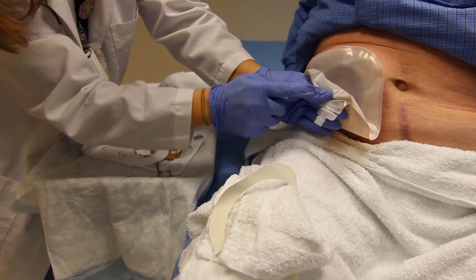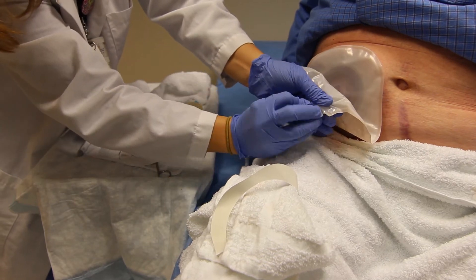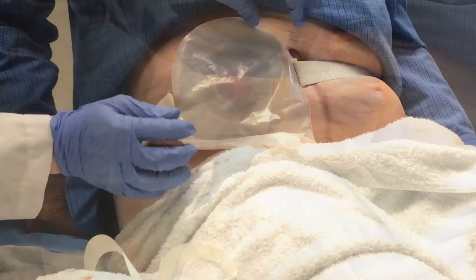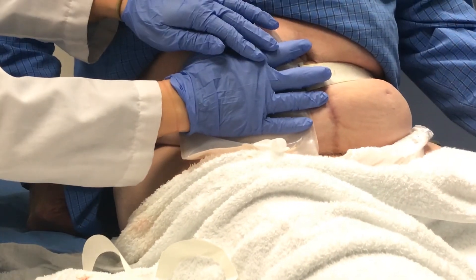Close the spout at the bottom. Cover the new pouching system with the palm of your hand for approximately five minutes to warm the wafer up and allow it to melt to the skin for better adhesion.